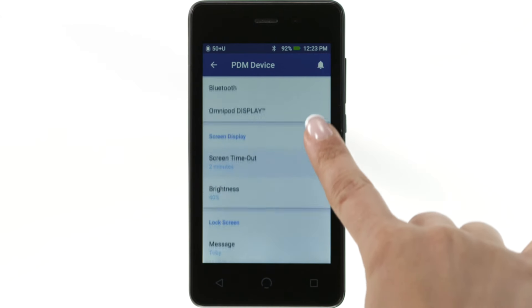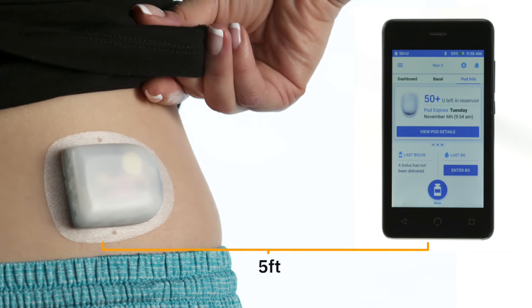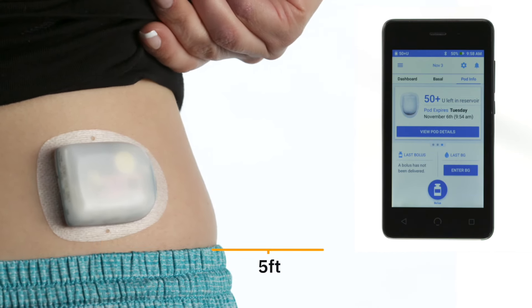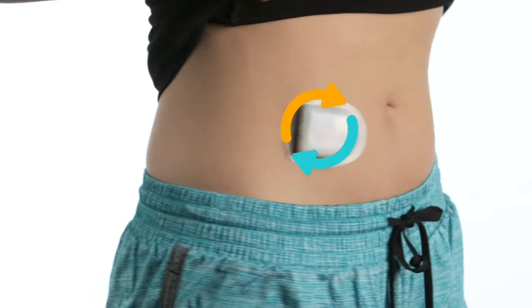The PDM does not automatically adjust time, date, or time zone. Be sure to adjust your PDM's time for daylight savings. If you are traveling to a different time zone, be sure to adjust the time zone setting. After activation, the PDM must be within 5 feet of the pod for communication. Once programmed, the pod does not need to be within range of the PDM for basal delivery to occur.